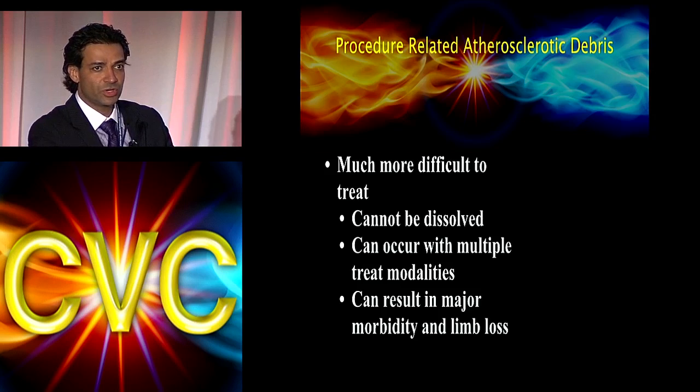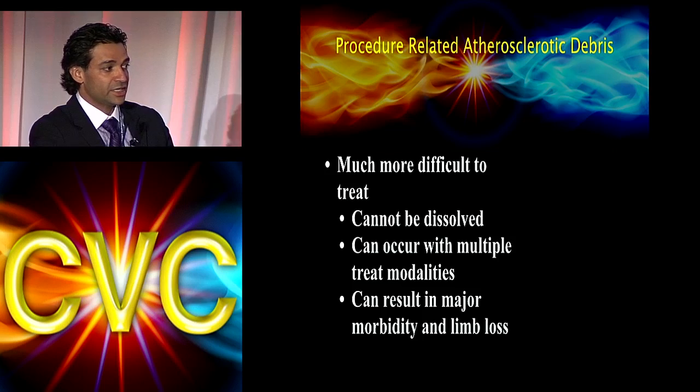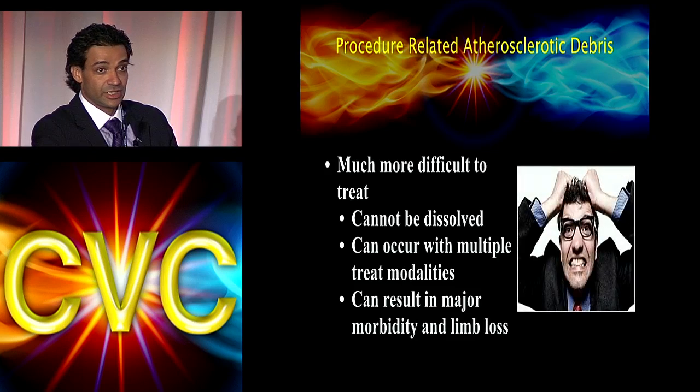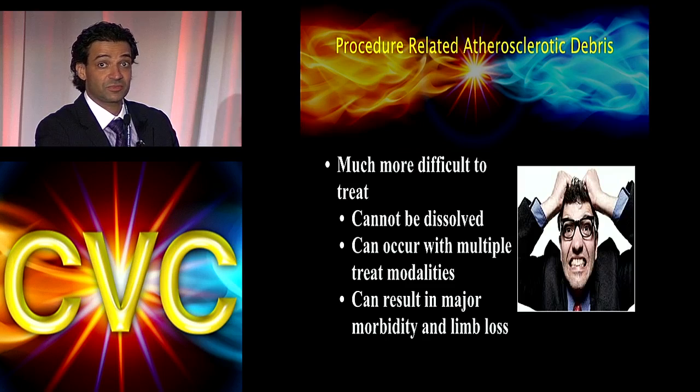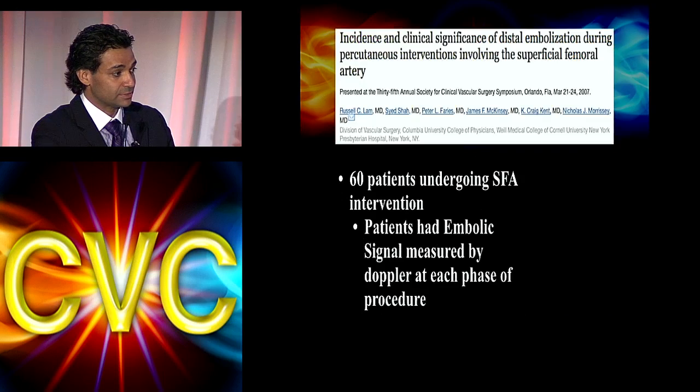What's even more difficult, however, is treating atherosclerotic debris, because it will not respond to antithrombotic medications. It is debris that you really have to either suck out or stent; you have to do something else to it, and treat it a little bit differently. It can also be very devastating. And again, the last thing you need after doing a long, complex procedure, or even something straightforward, is to have a complication like that and send your patient to either surgical treatment or amputation.